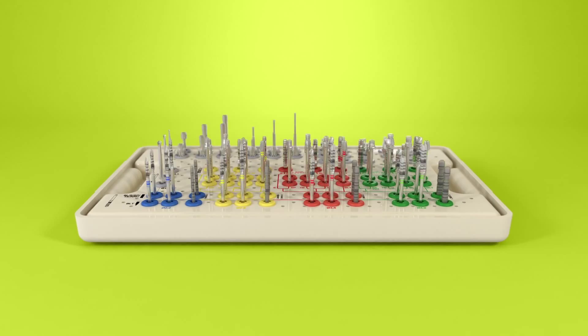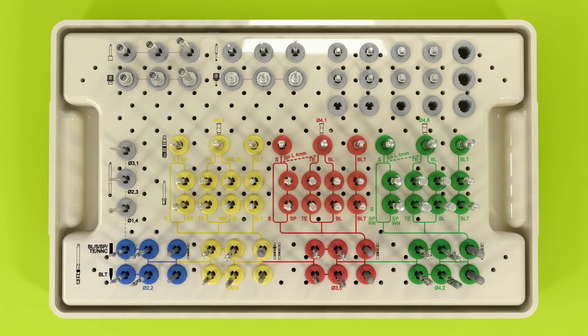The upper tray contains all the devices and drills needed for placing any Straumann Dental Implant. The layout of the upper tray has three horizontal areas.